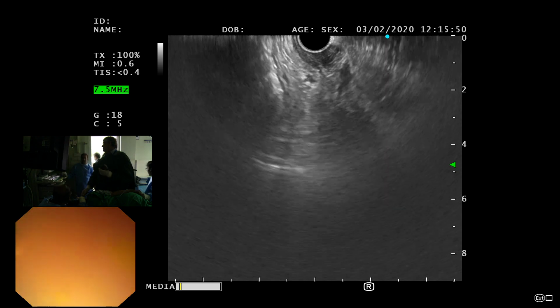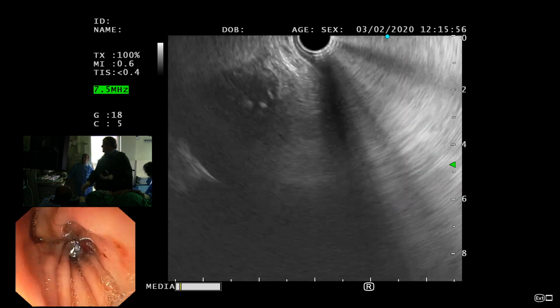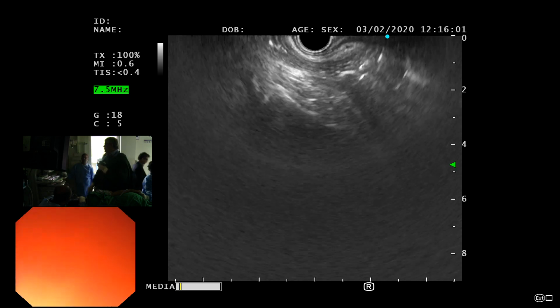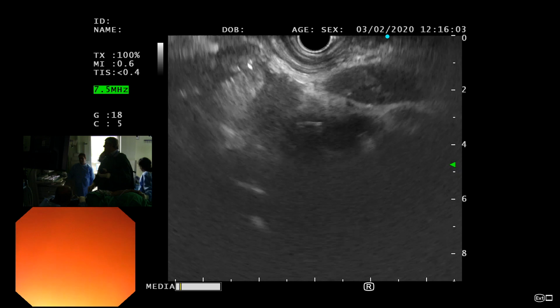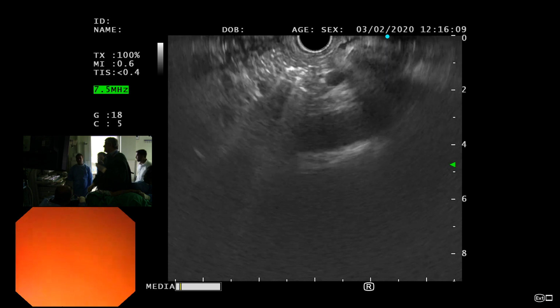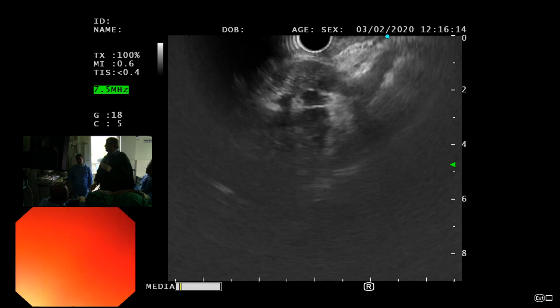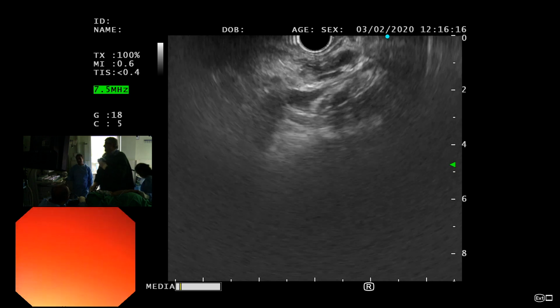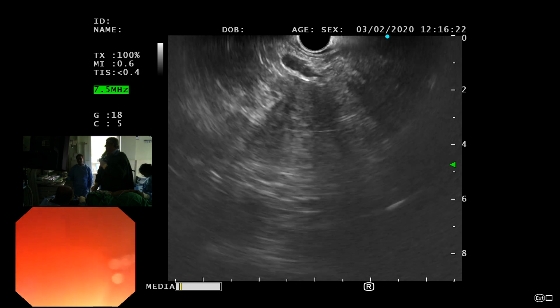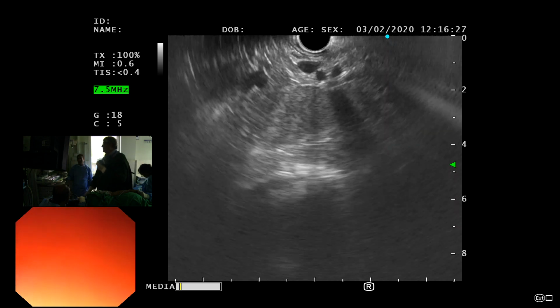No, I was thinking that this may not fit autoimmune, because from below too the whole thick wall is coming, and its mucosa looks intact. That was my main issue. The reason why I wasn't sure is I haven't seen that many autoimmune, so that's why I asked Khalid. The issue is that the tail of the pancreas here, you're following it, and here the pancreas starts disappearing. You're absolutely right. It's completely atrophied. So that's what made me think whether this could be autoimmune or not. I don't know if that's possible in autoimmune.